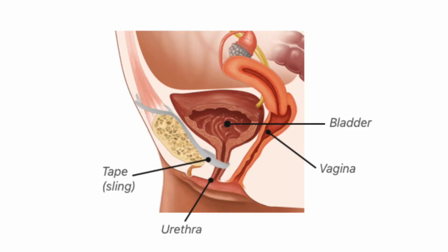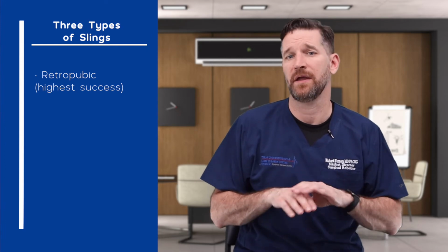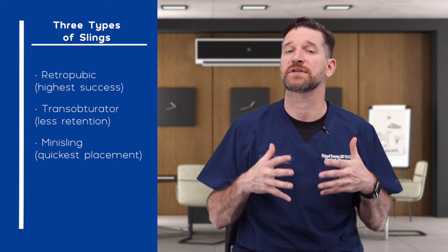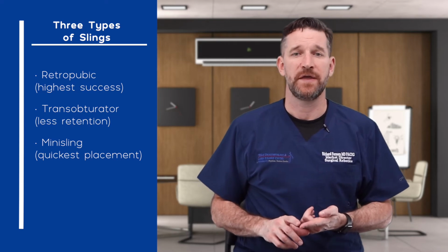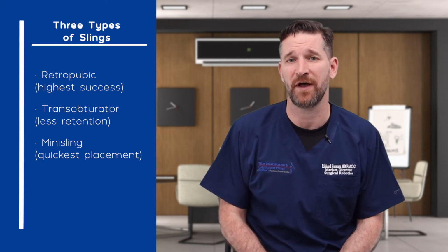People call it a bladder sling. It really has nothing to do with the bladder. It's not in or around the bladder. It actually just cradles the urethra. The mesh incontinence slings come in three varieties. One that cradles the urethra like a hammock, one that sits under the urethra, and a mini sling. And these are all very popular. In fact, they're the most common surgery for stress incontinence. They're common because they're easy to do, have a very high success rate, and a very good safety profile.